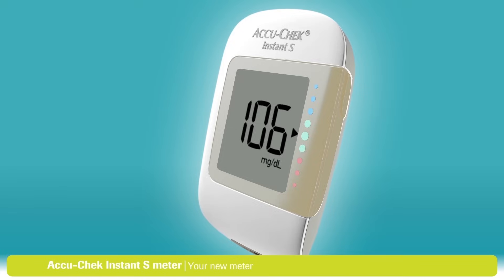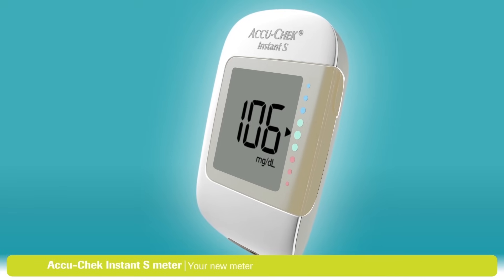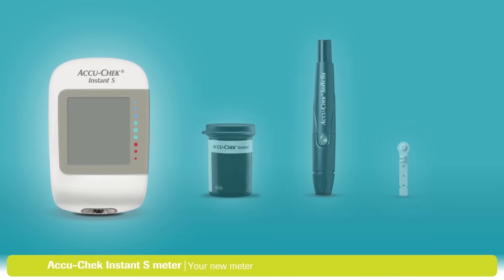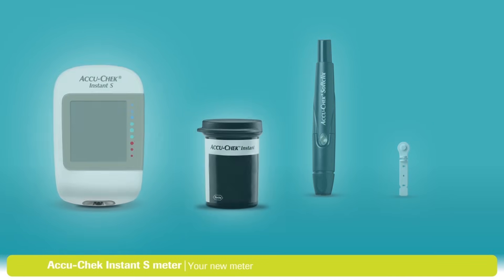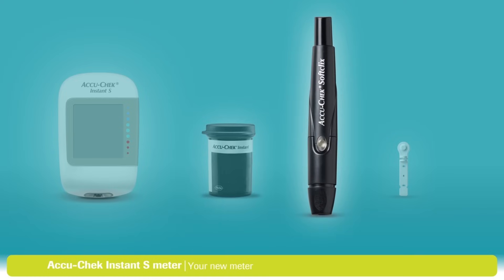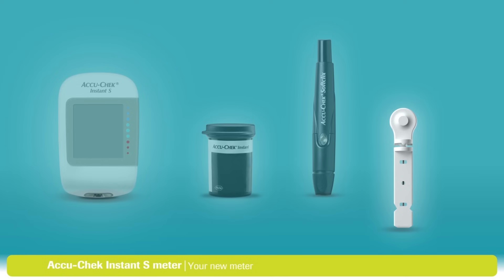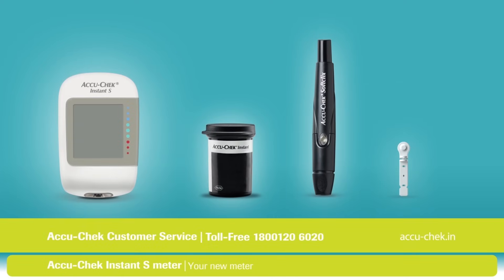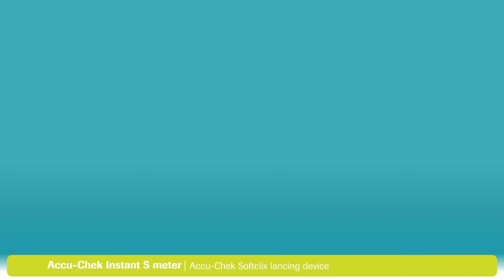The first thing to do is to make sure that you have everything you need to start testing. You should have the following items: an AccuCheck Instant S meter, a container of AccuCheck Instant Test Strips, an AccuCheck SoftClicks lancing device, and an AccuCheck SoftClicks lancet. If you can't find something or need assistance with any of the steps, just contact AccuCheck customer service.